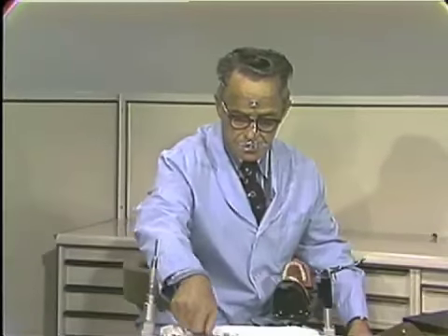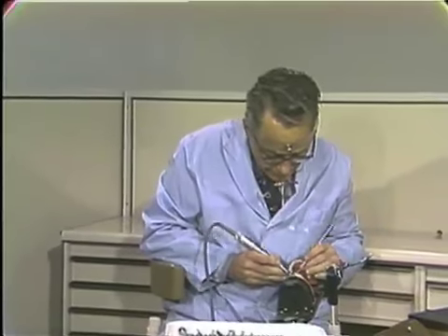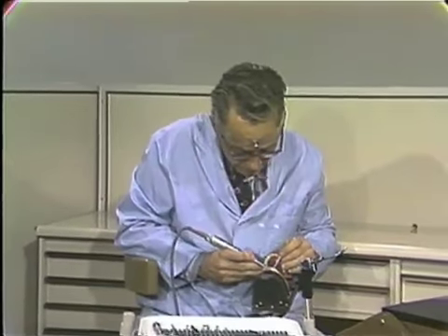The fine diamond or a small 242 burr will be used to put these bevels connecting the two slices and also to bevel the angles at the entrance of the prepared cavity. We will test our instrument to see that it runs, and then place it into the cavity in a very straight position.